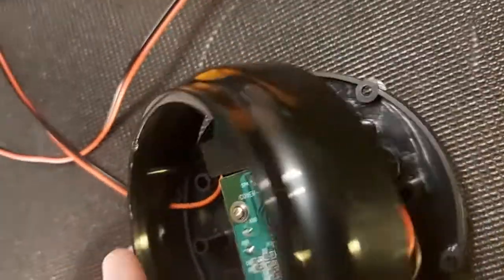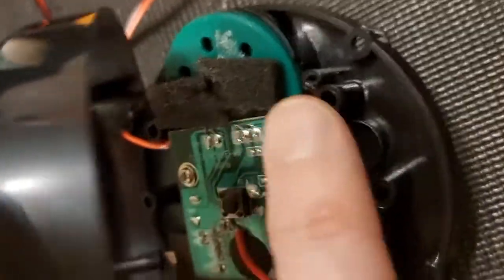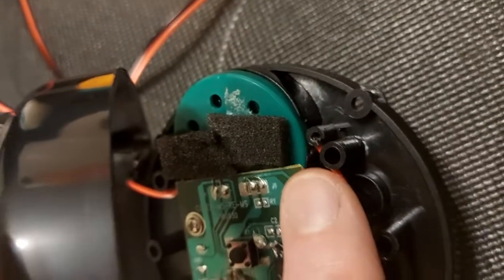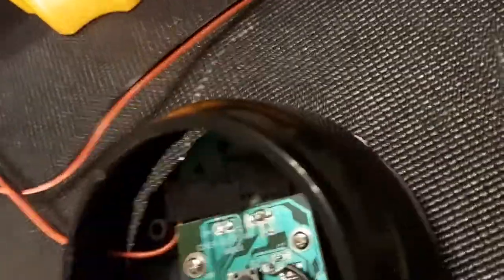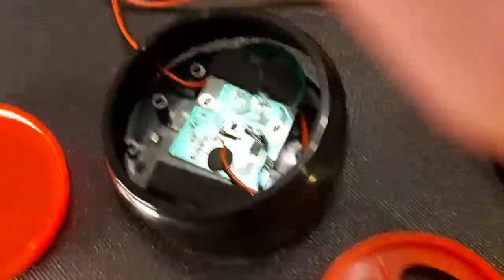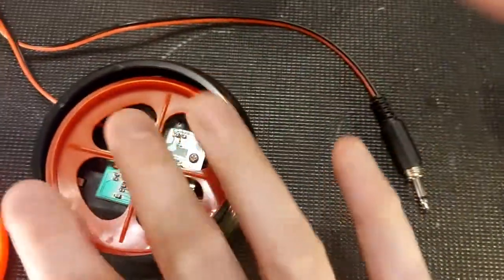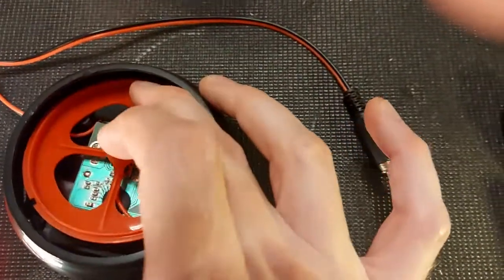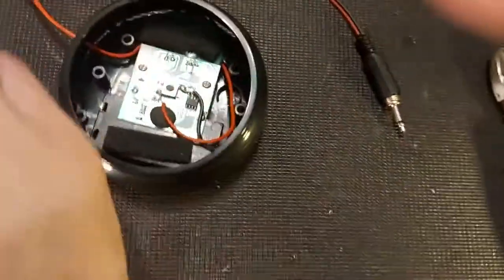I snipped out all the extra stuff we don't need. One thing specific to this switch — and again this is more of a concept — I found I had to put the microphone back in. I pulled it out and disconnected the wires, but it was actually weight-bearing because the assembly sits down on top of it, and without it the assembly kind of collapses to the side instead of pressing down on the switch nice and flush.